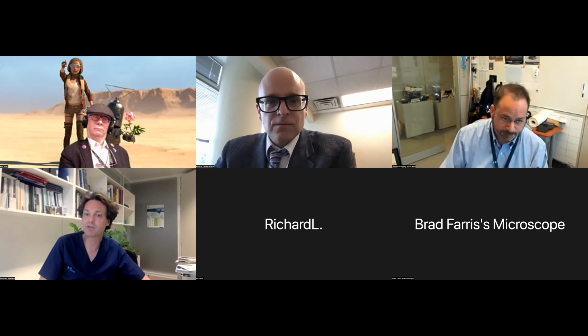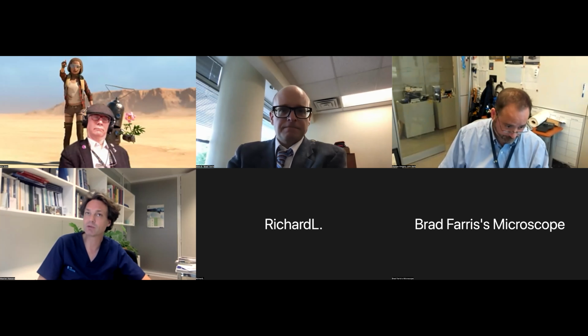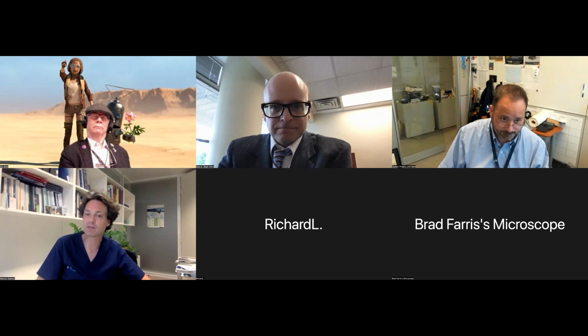Yeah, fantastic. And this is beautiful. And this is indeed the way to confront the AI pipeline with the human pipeline, because otherwise, if you don't analyze the human pipeline in the same detail as the AI pipeline is working, you'll never have a good evaluation of the kappa statistics. So I agree with you. This is the way forward.